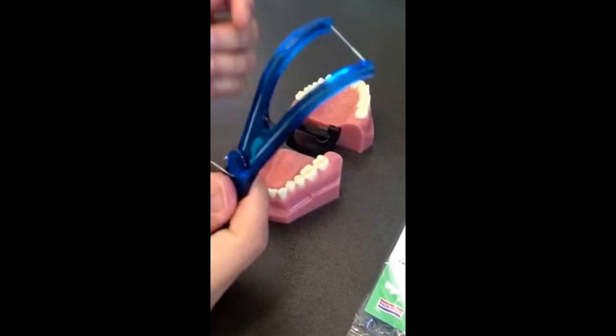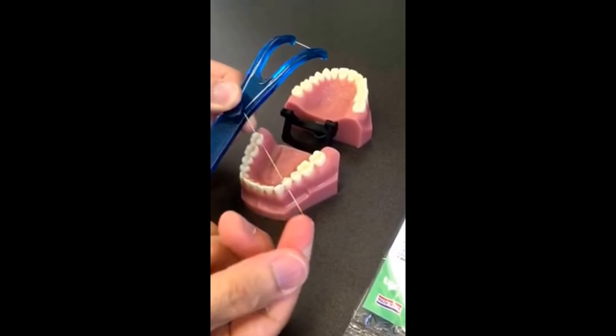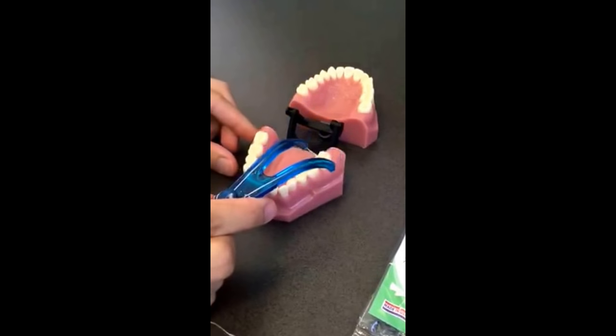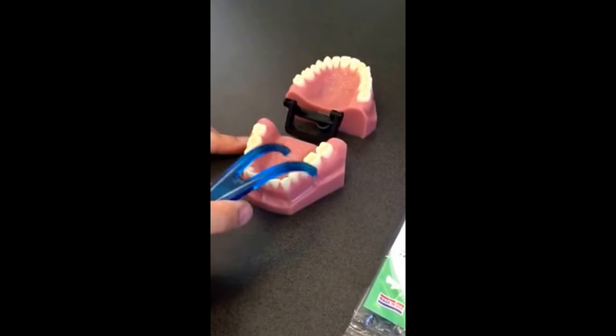The handle can be reused — all you need to do is change the floss. This makes flossing much easier for those hard to reach places and can be used for both kids and adults alike.